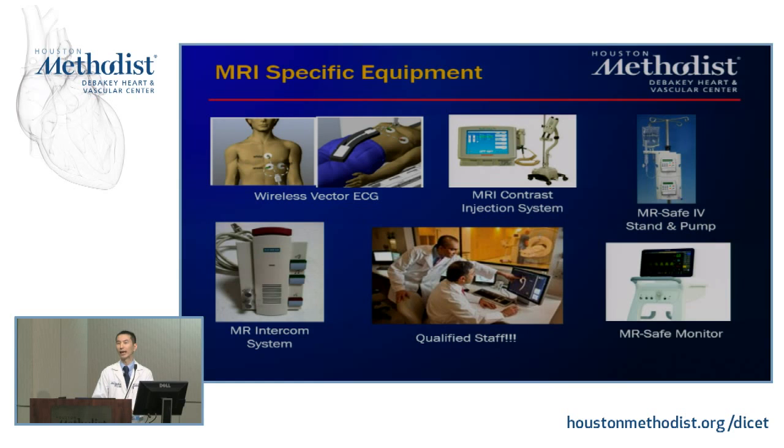And not just any MRI can accomplish this. This has to be a cardiac MRI capable scanner. These scanners have to be able to track the patient's rhythm, because you need to gate it and compensate for the cardiac motion. Hence, we have ECG systems with electrodes that are compatible with the MRI. You can't just put any electrode in, and one of our CMR fellows discovered this one weekend with his volunteer.